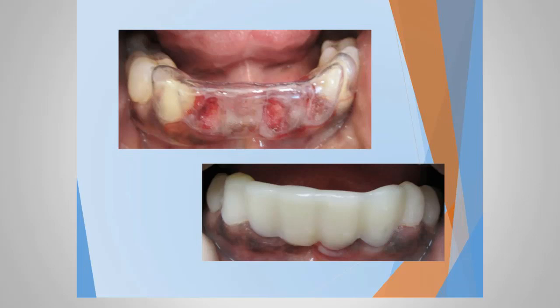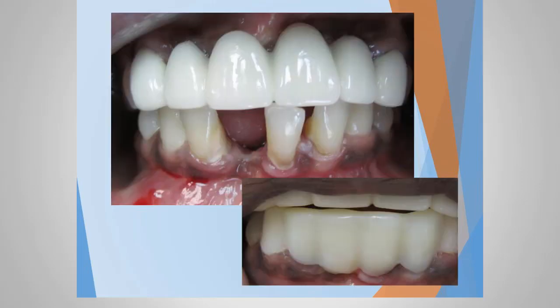I like to wait at least 2 to 3 months of healing and filling of this bone because of the extraction. So what this lacks in definition and prettiness, it makes up for in strength. It was able to last a long period of time and allow that area to heal up and be right for the final impression. Again, this is how we started, and this is how the temporary looked.